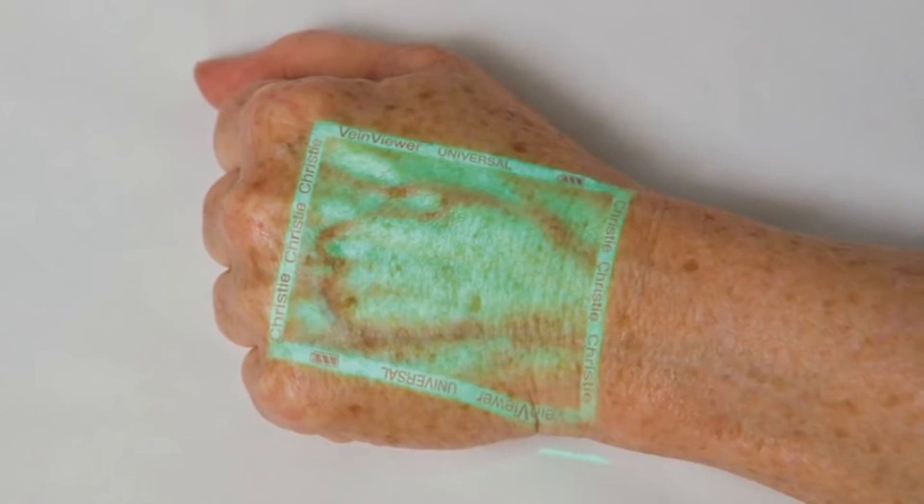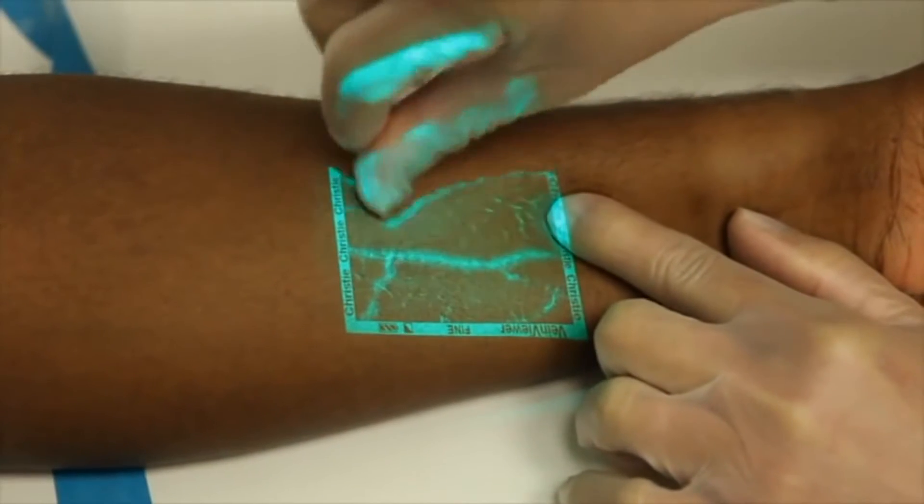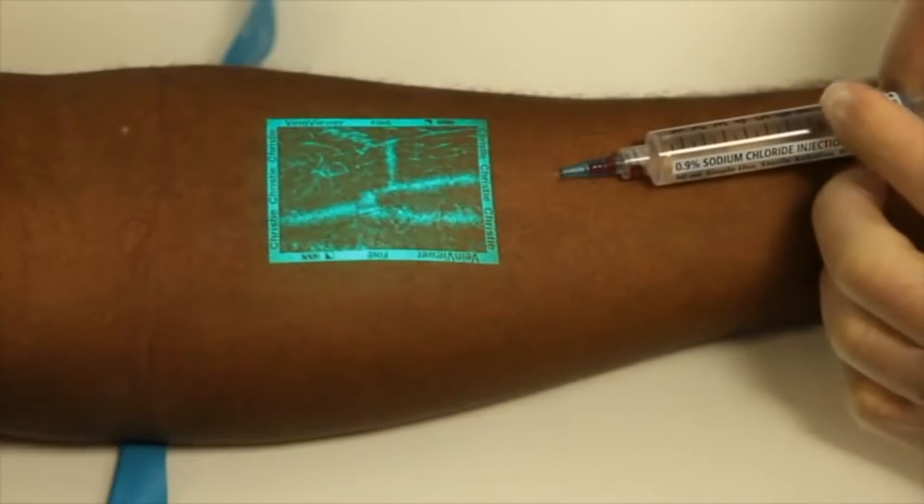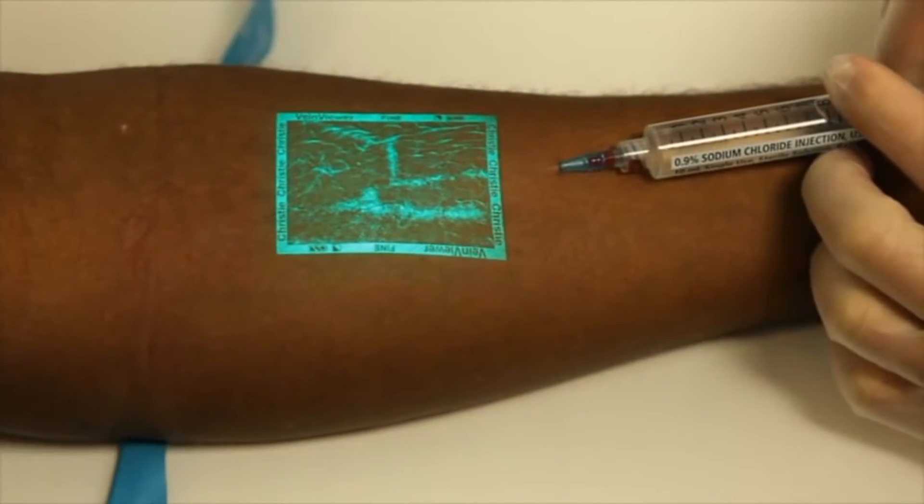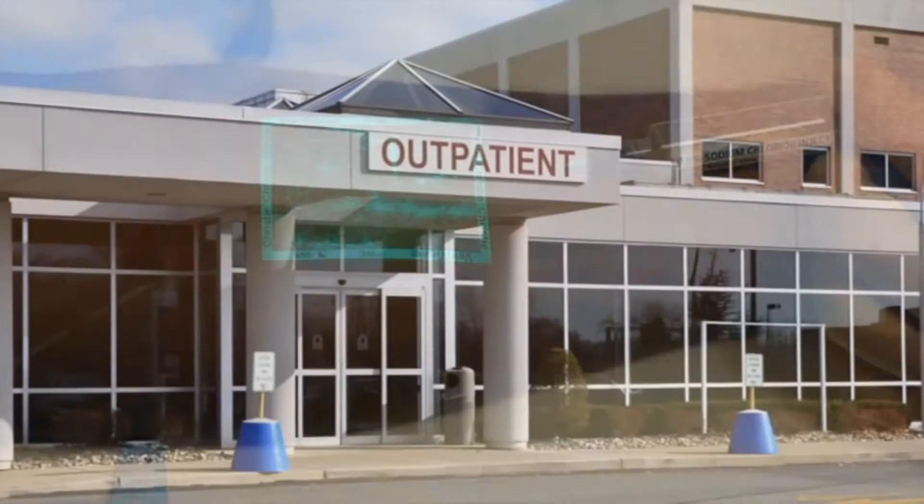Imagine the even greater value of a device that could help identify hidden valves and bifurcations, as well as visualize refill and flushing of veins and potentially help avoid infiltrations.